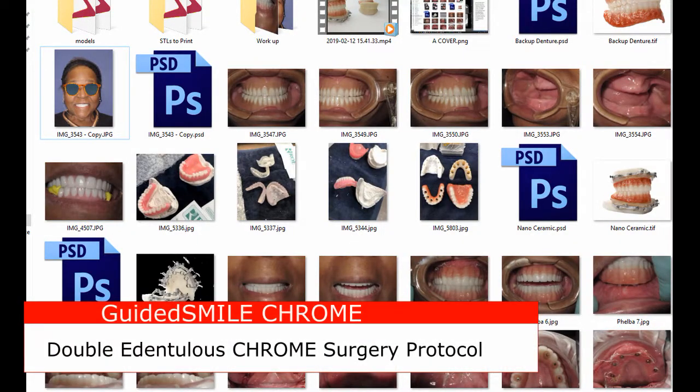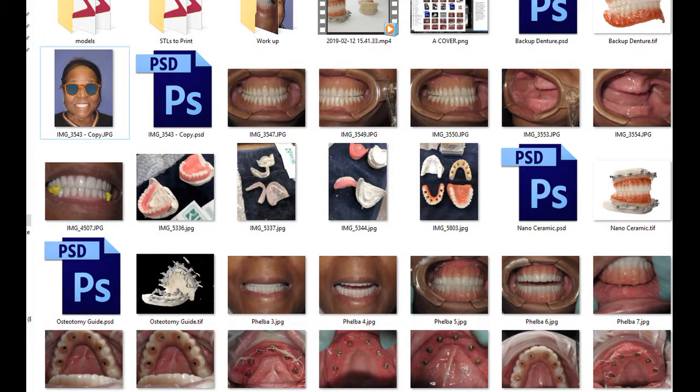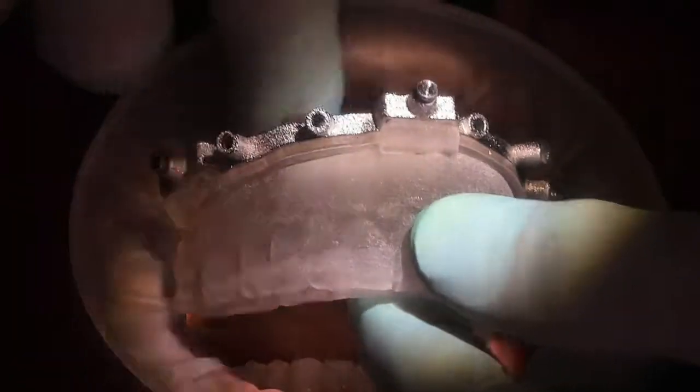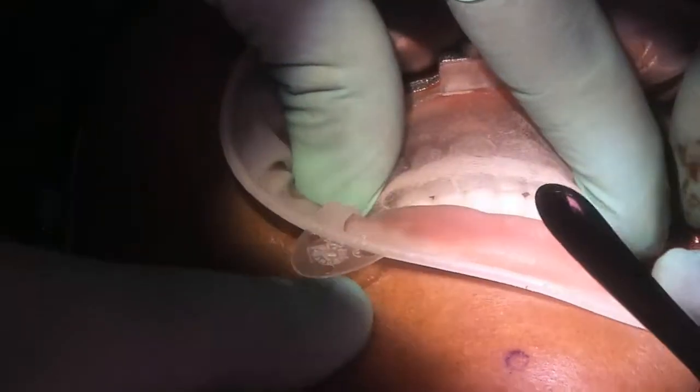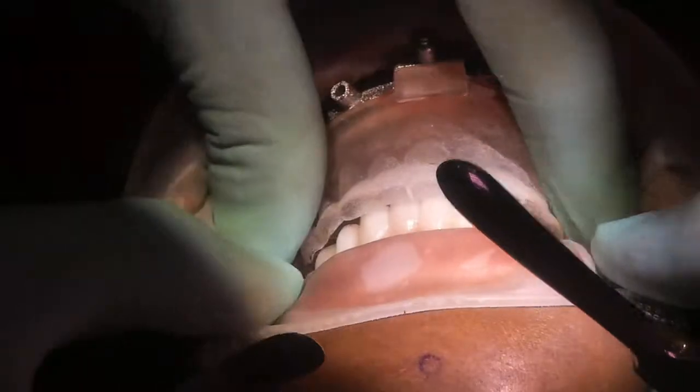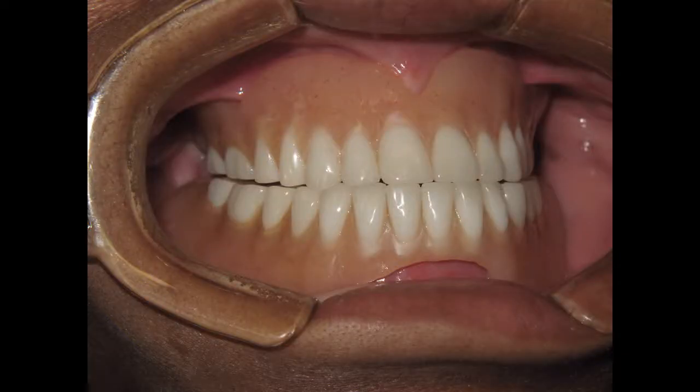This video will explain the double edentulous guided smile chrome technique from records through surgery. Double arch edentulous surgeries are very different than other chrome surgeries. The pin guide and the flap are used and designed much differently than conventional chrome. The pin guide is a soft tissue supported guide and must fit the tissue intimately, and the occlusion must be exact. The successful outcome is a result of the pin guide fitting exactly as the patient's existing dentures or new dentures fit. It is critical that the steps are followed for surgical and restorative success.